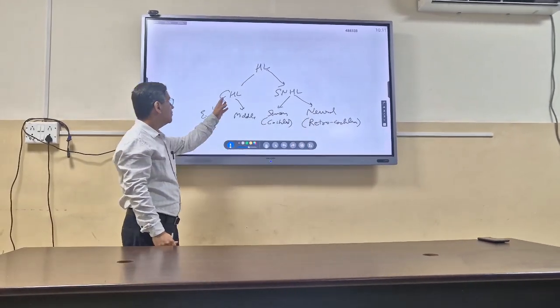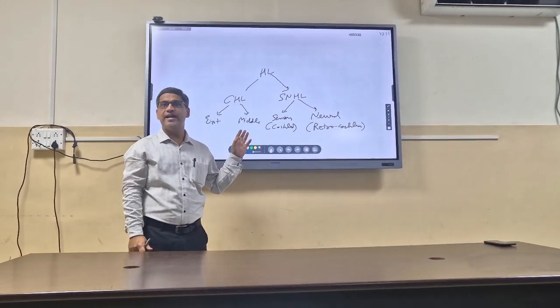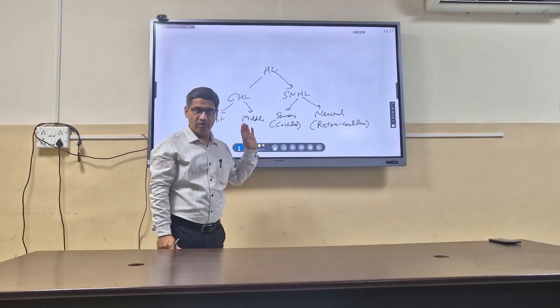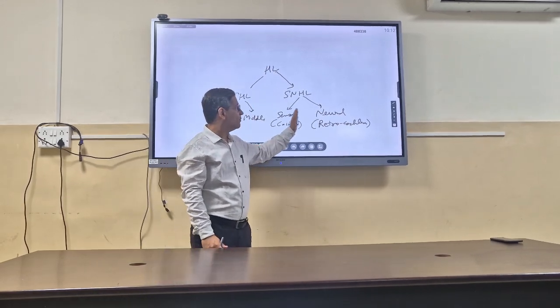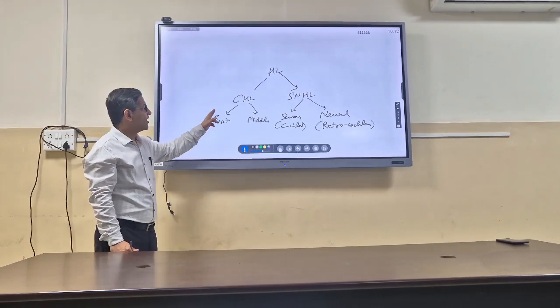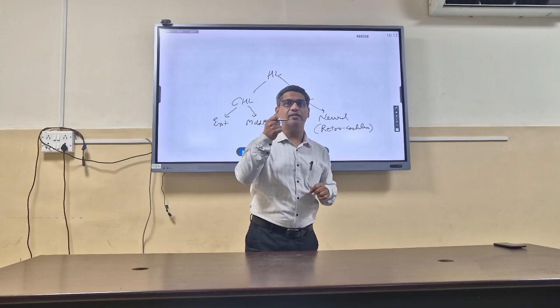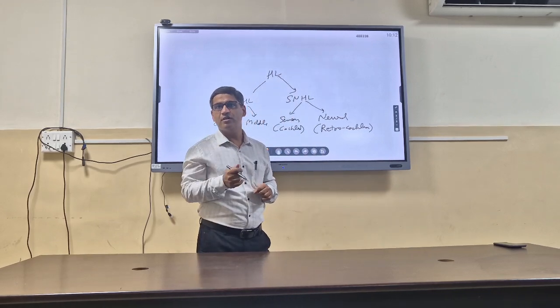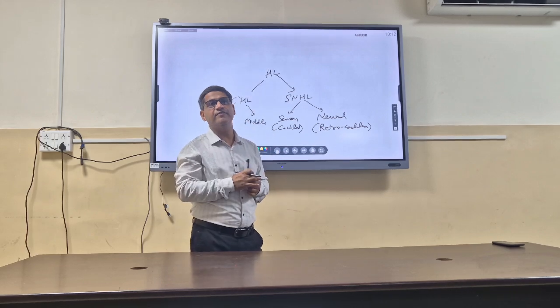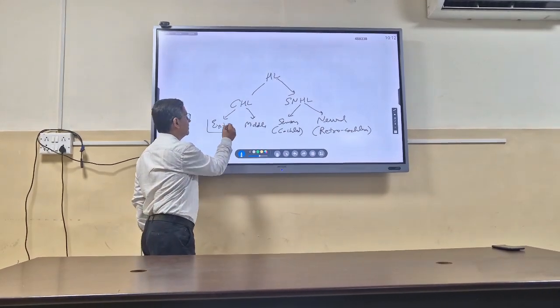Fine. Now if the patient has conductive hearing loss, either the external ear or the middle ear is involved, because anything involved beyond that would be SNHL, not a conductive component. Now, the external ear we can examine with a Bull's lamp, headlight, or torch, and we can examine the canal as well as the tympanic membrane with otoscopes. So up to the external ear we can examine.